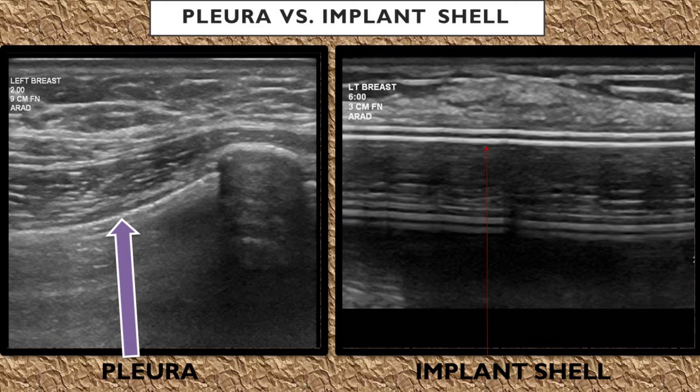With pleura, you're going to see a bright echogenic white line, and anterior to that is going to be striated muscle.